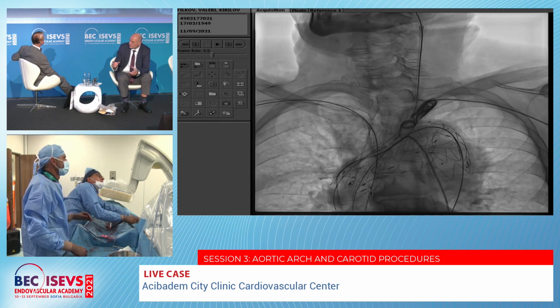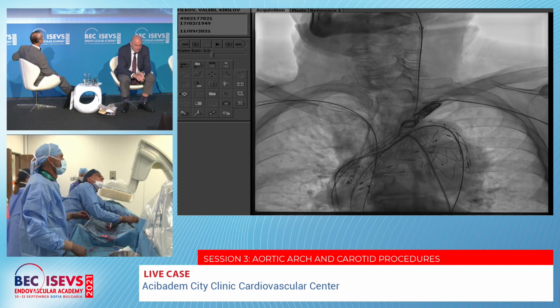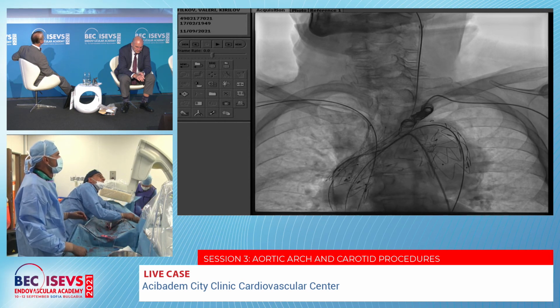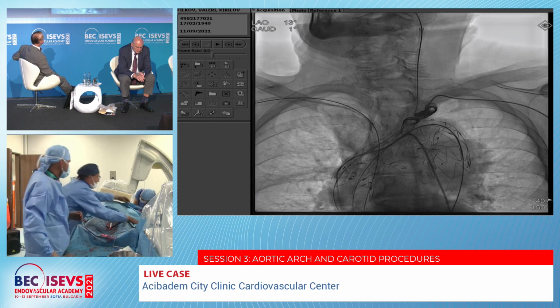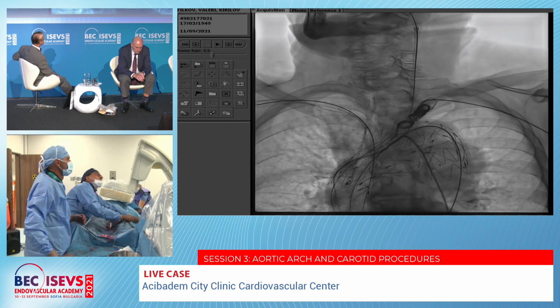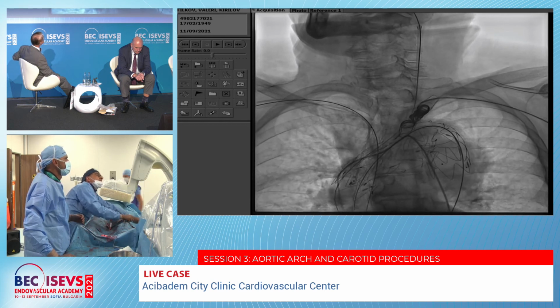He's trying to compact the coils. Yes, Petrov wanted to push the coils together. Here you see it. It works, but he will not be able to push it down into the aneurysm sac itself, because there is already one coil there.